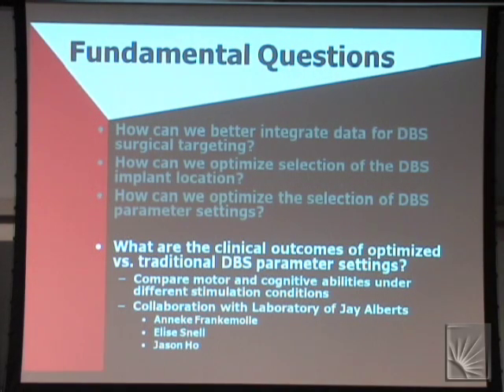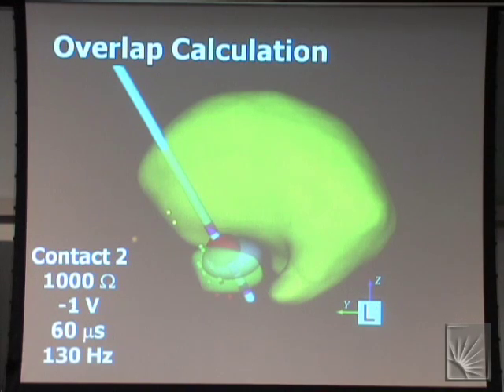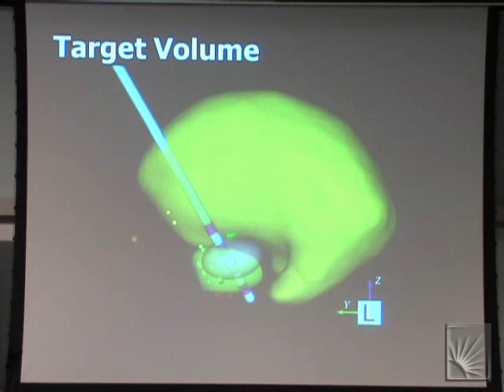So, can I ask you, in the previous slide, shouldn't you move down one contact to match with the... Well, so the issue is that the STN, in my opinion, is not the actual electrical target of the stimulation. And that's what this black blob is really getting at here, that there's a major fiber pathway coming right through this area called the lenticular fasciculus that in every computer model we've ever made of human subjects and monkeys is directly stimulated during therapeutic efficacy.